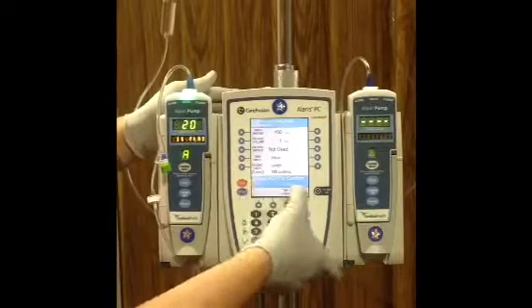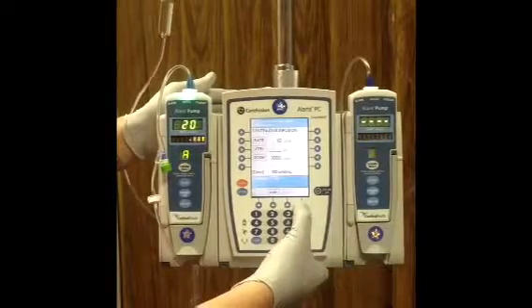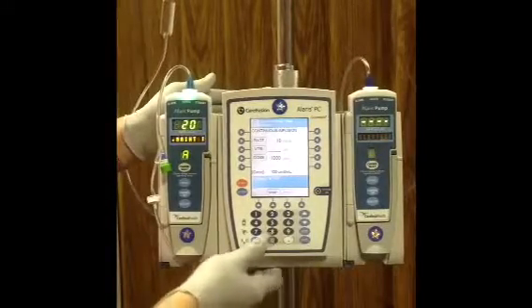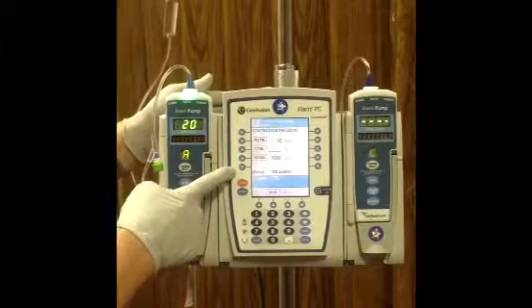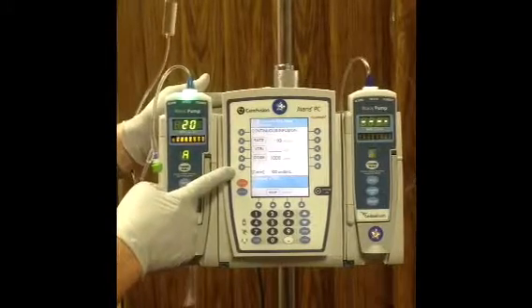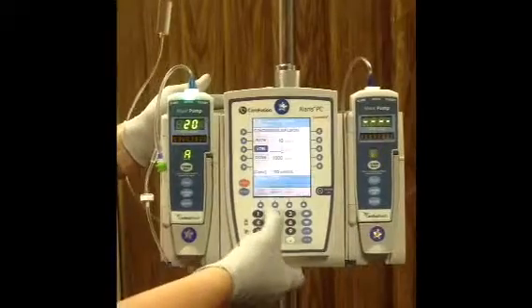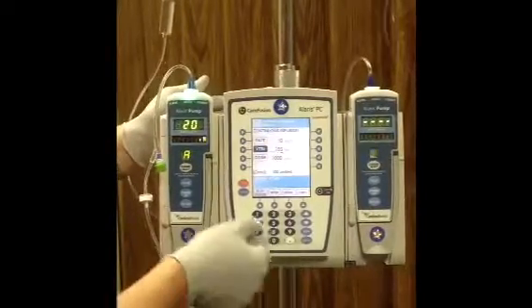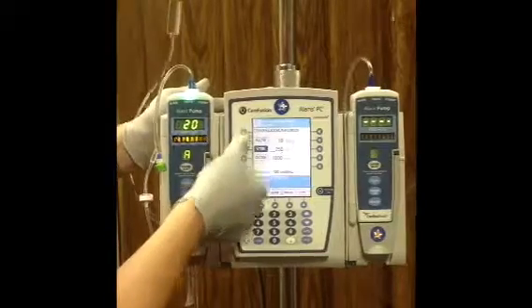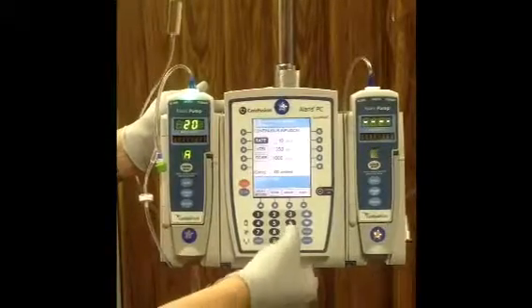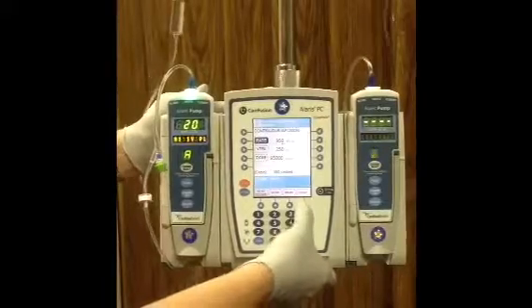Just confirming that we have the right concentration, and press next. Here's where we can program in our infusion according to the order. We have a volume to be infused of 250, and per our order we're going to be giving 950 units of heparin. So we program that in and go ahead and hit start.